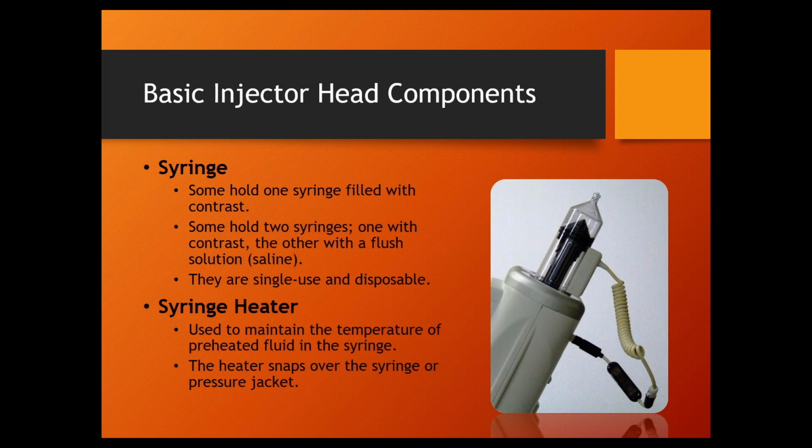So when we train a student, one of the things we have them do is make sure the first time you go out and do a PM on a Stellant or whatever model, when you get to the department, ask them for a set of syringes. Now the syringes, like all syringes in the United States anyway, some countries don't do this, but the US does. They're one-time use only, all right? This syringe gets used once and it gets thrown out, okay? So the imaging department has literally cases and cases and cases of these syringes, and they're roughly $10 per syringe. They should have no qualms giving the BMet a set of syringes to do their PM.